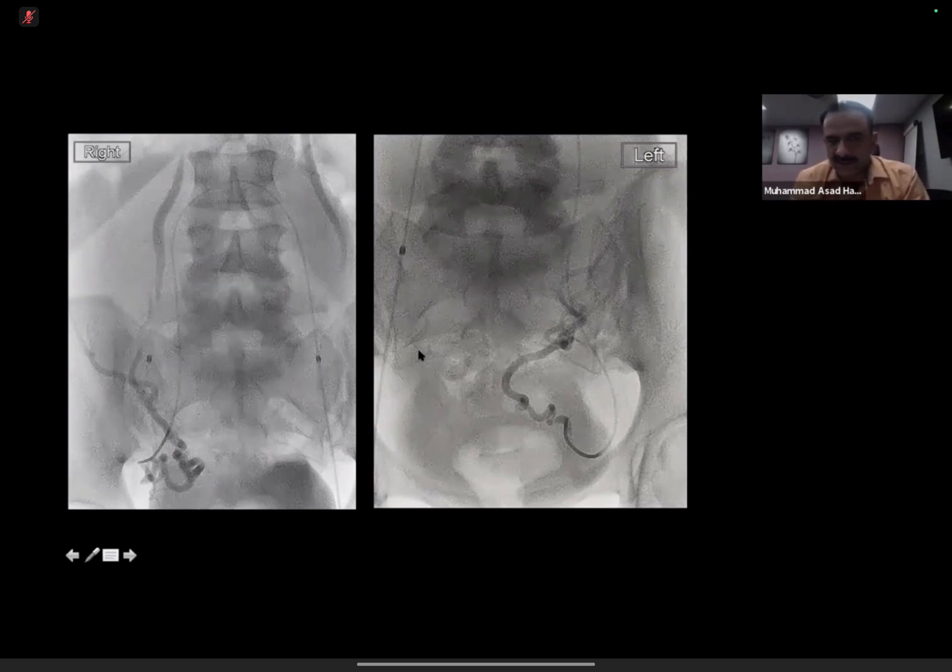So this is the image representation of the uterine artery embolization. It can be performed through the one-side access or both sides. We may have to get access from the femoral arteries. Up and over approach is used to selectively cannulate the uterine arteries, and then those are embolized.